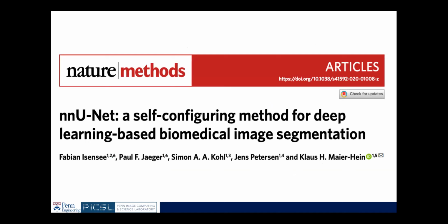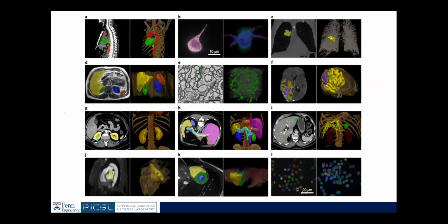Yeah, so the next paper that I want to discuss is nnU-Net, which is nothing but the U-Net that you saw with ResNet modules and a bunch of other nitty-gritties. And this is arguably, in our opinion in the lab, probably the state-of-the-art segmentation network for medical images. I highly recommend you go and have a look at this paper and the GitHub repo, and if you want to try it, please do so. It's really easy to set up.